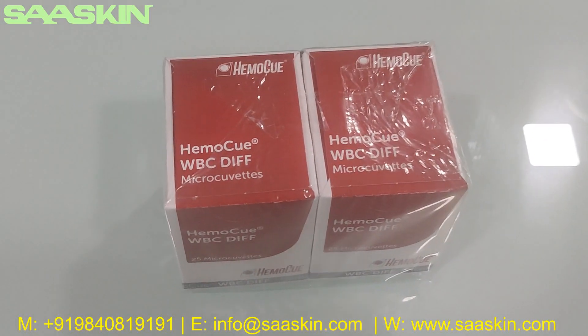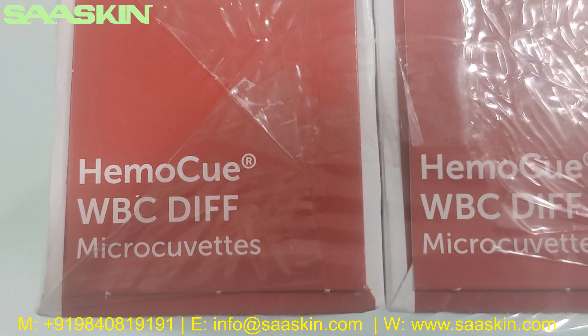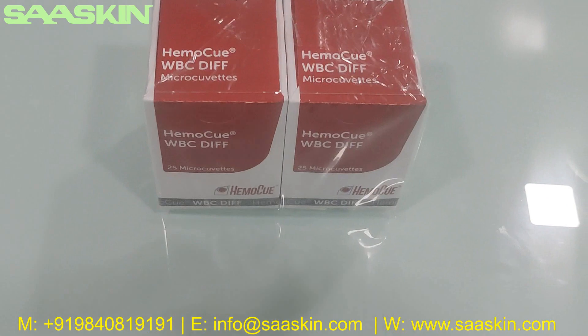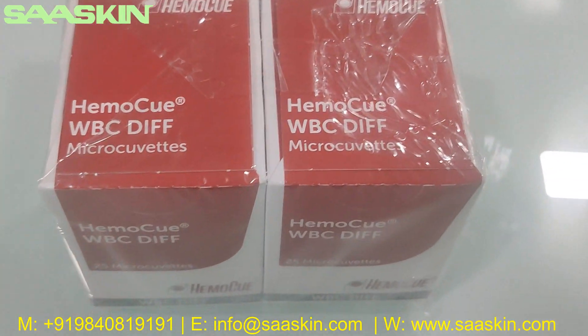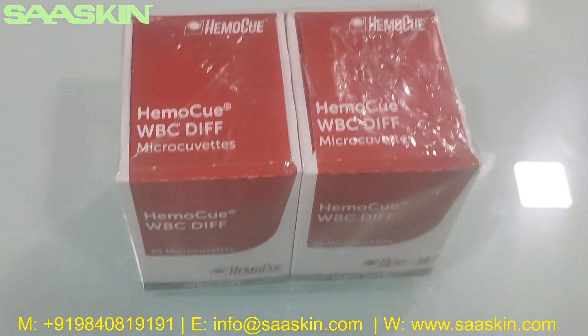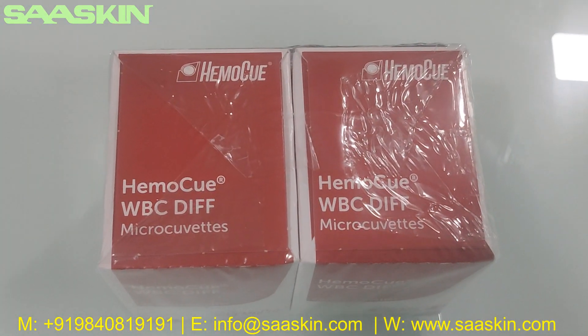Hello everybody. Today we are going to see the unboxing of HEMO-Q WBC differential microcubets. These are used along with the HEMO-Q WBC differential analyzer, and are basically used for the differentiation of white blood cells.